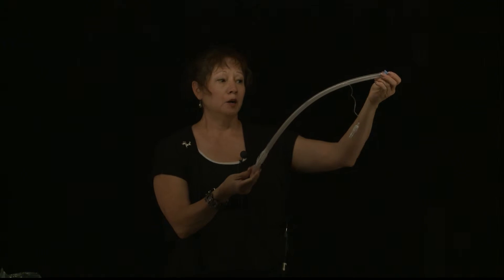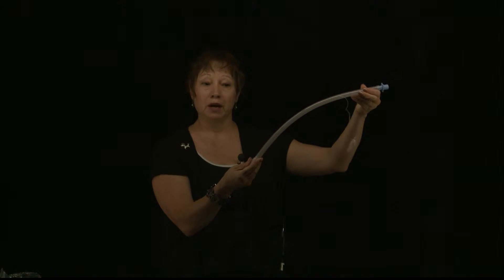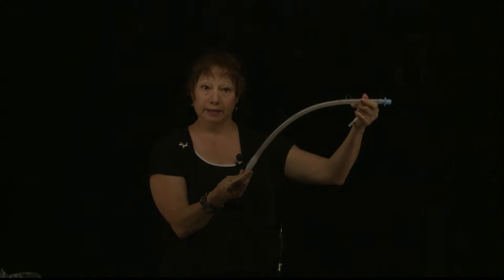Check your machine, check your seal. When we talk about larger tubes — for example, an 11.0 larger tube for a Great Dane — the principles are the same. Normally you would use a 12 cc or 20 cc syringe to inflate this cuff, but once you have it moderately inflated, you always want to go by small increments when you're checking the seal.